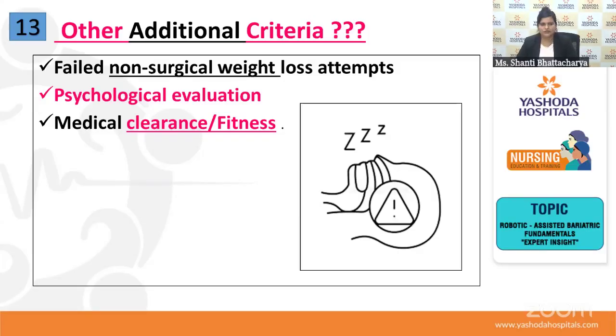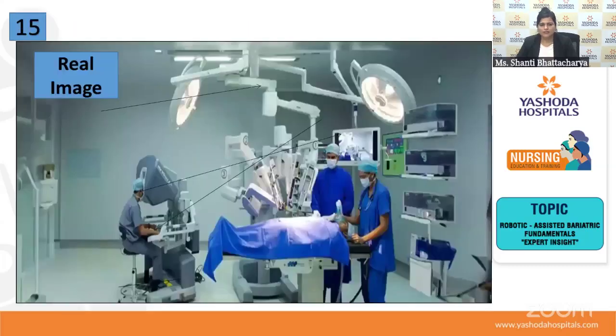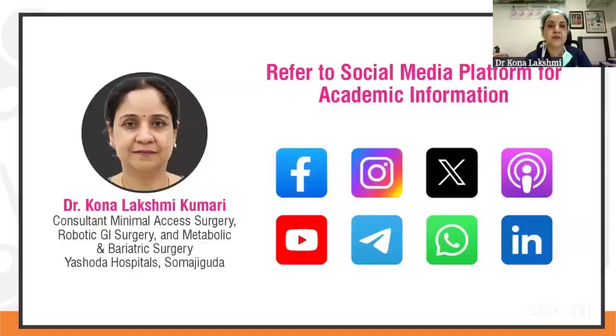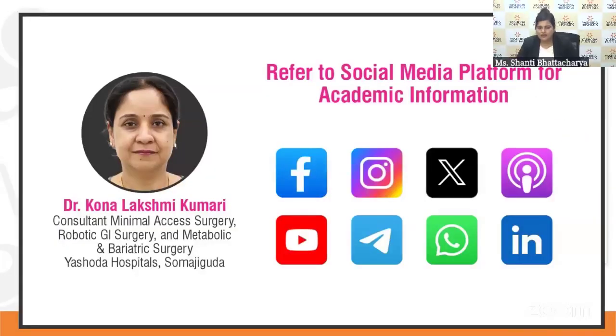Having said so, we also spoke about the main components, and this is the really major one. This is called the surgeon's console. We wanted to give the viewers very light and concise information. Because this is to begin with, we have tried to put only these points, but Madam has already done one video, which you can see.